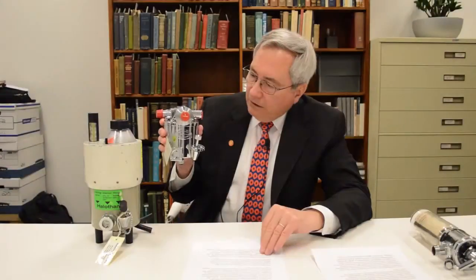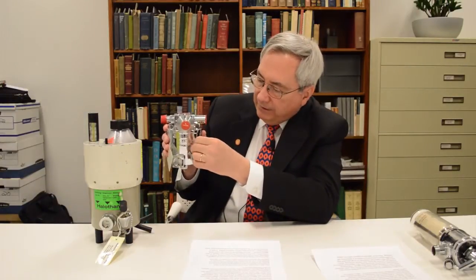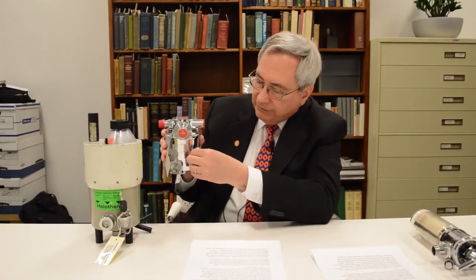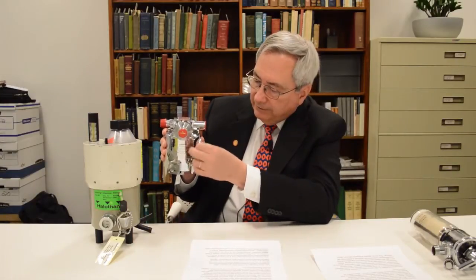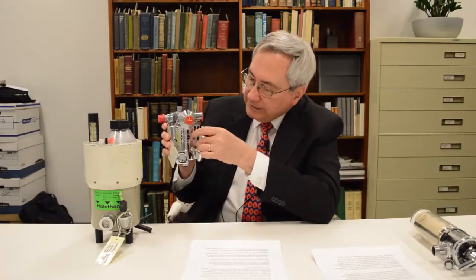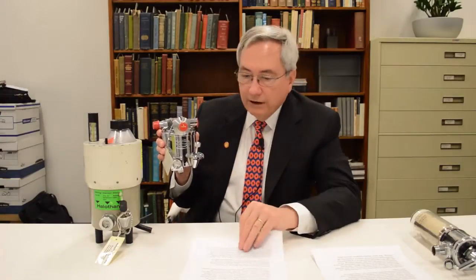It was also a temperature compensated device. So if you look at it here, it has a method that you can add your liquid agent into the vaporizer. You could look at it and see here how much you added into it. It has a control valve on it.